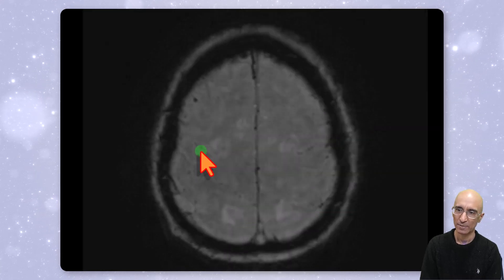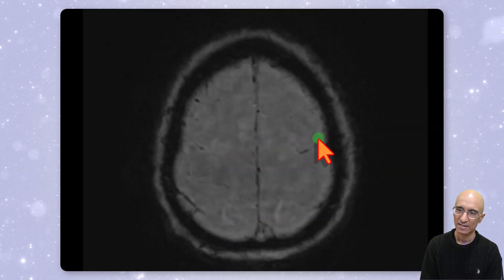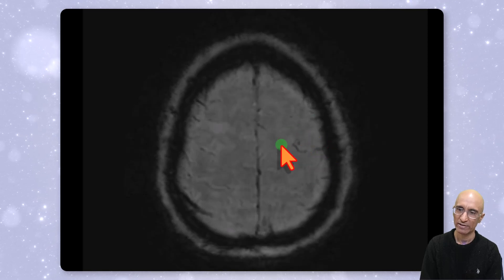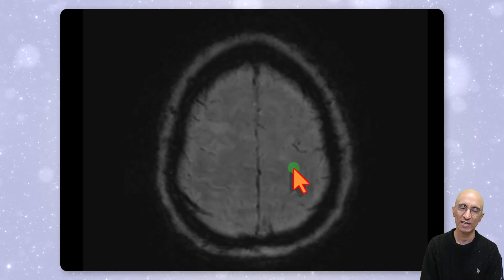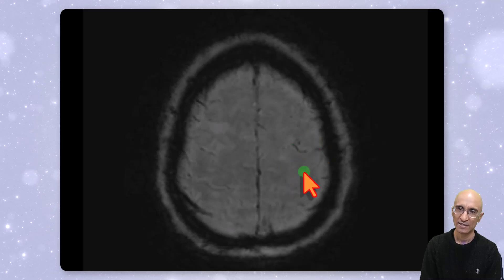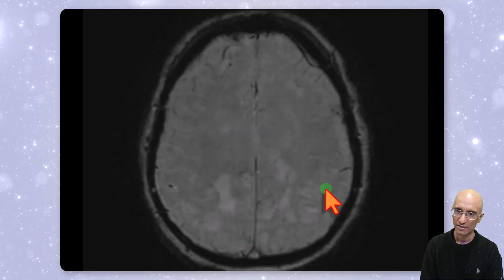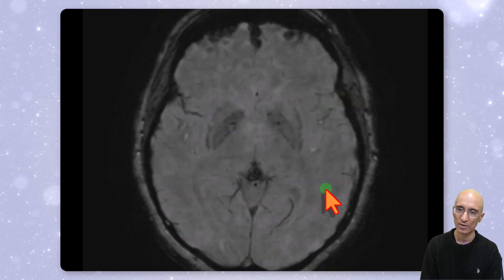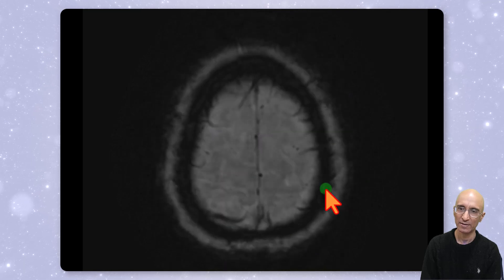On the axial SWI images, we can see subtle susceptibility in the left frontal region, which corresponds to the hyperdensity we saw on the CT head examination, consistent with sulcal subarachnoid hemorrhage. As I scroll through the SWI images, there is no other focus of acute hemorrhage seen in the brain.